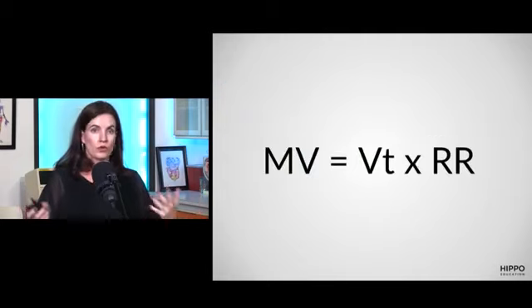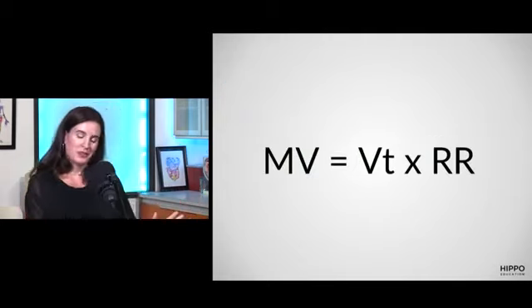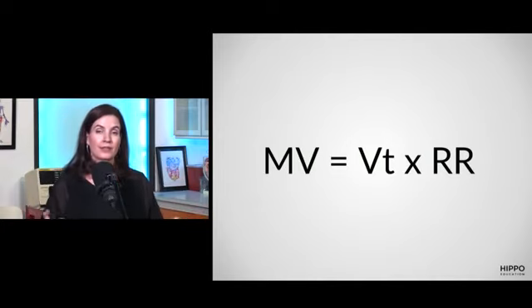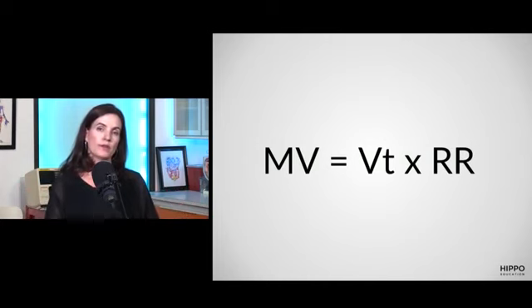Now, the way I remember this is the only formula I'm going to give you. And so if it works for you, you can remember it. But your minute ventilation is tidal volume times respiratory rate. And so when I think of people who need to blow off more CO2, I can remember that they need to increase their minute ventilation, which then cues me to those changes on the ventilator, that those are the two things I can increase to help expand their minute ventilation, which will help them blow off the CO2 that I'm looking for.